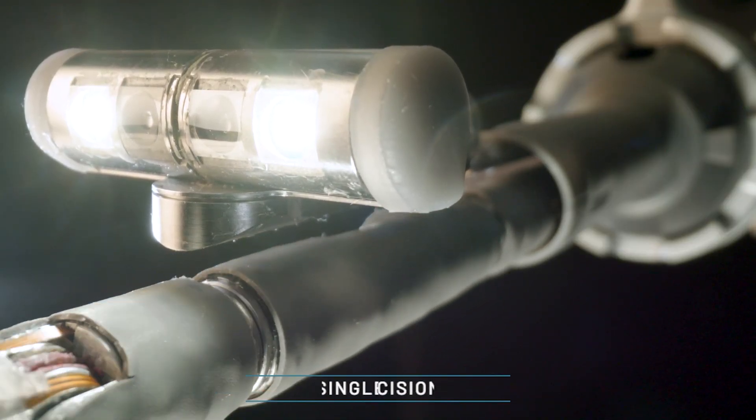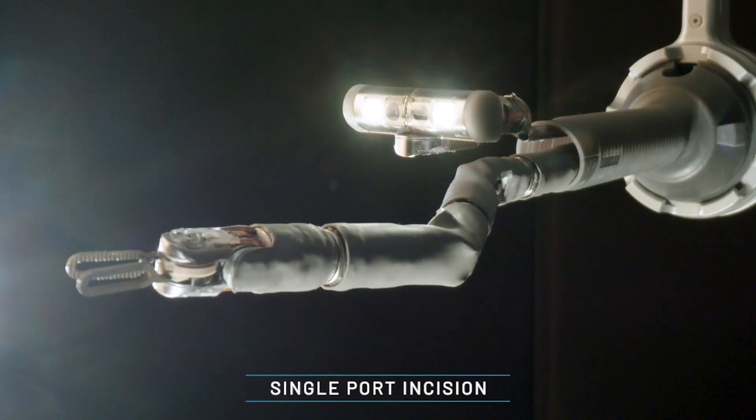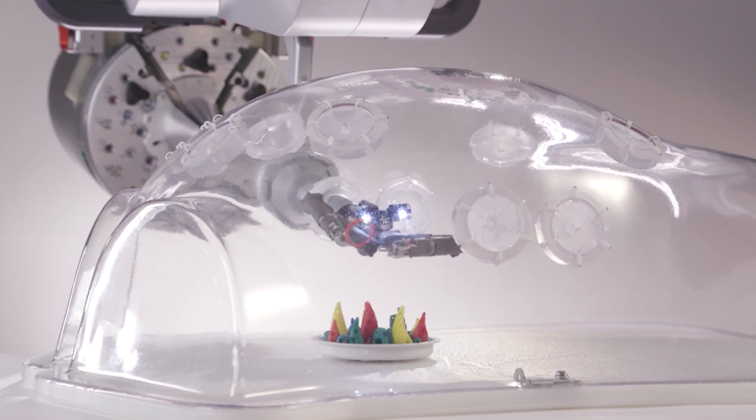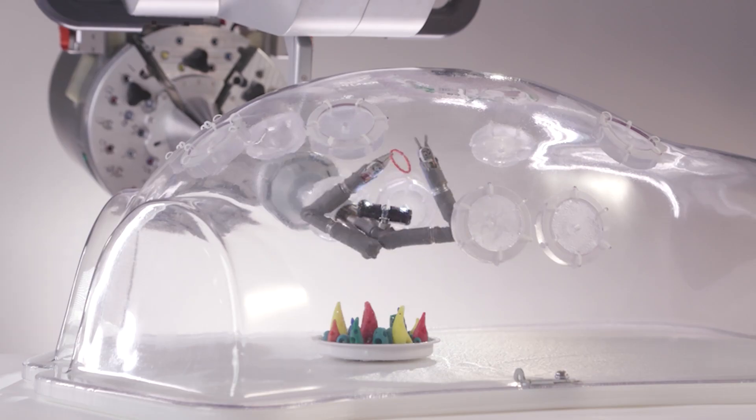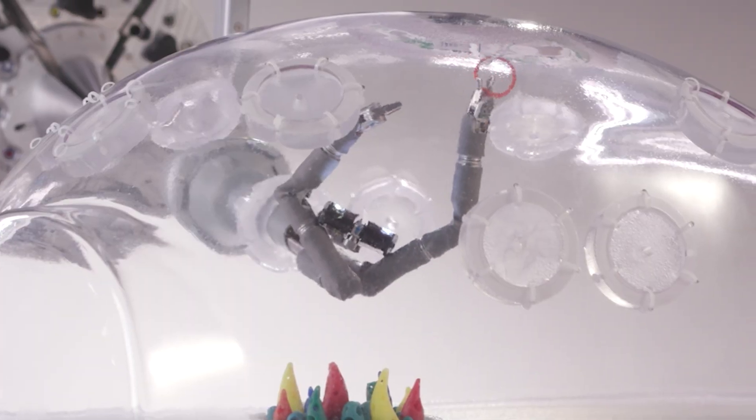With just one small 1.8-centimeter incision, the Vicarious Surgical robot maximizes surgeon abdominal access and visualization.